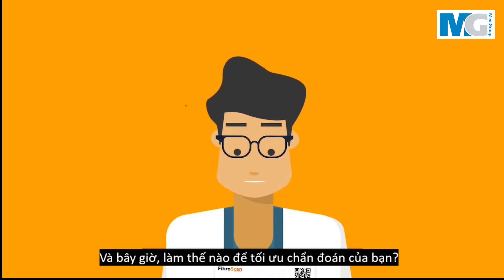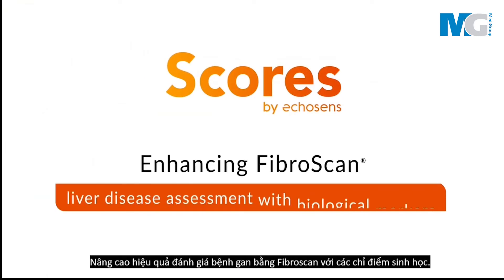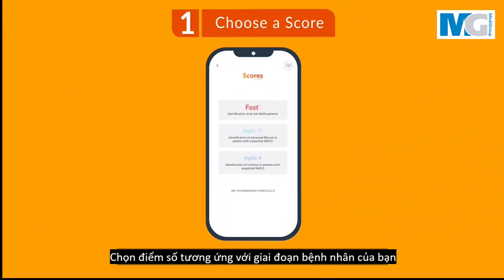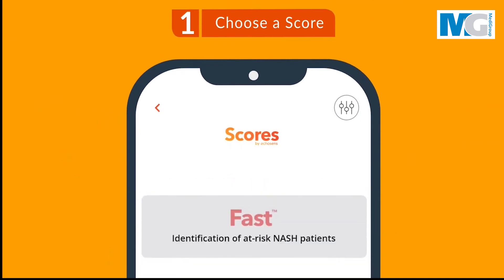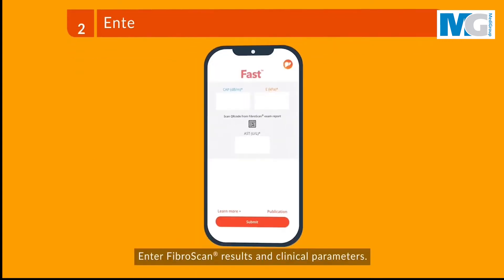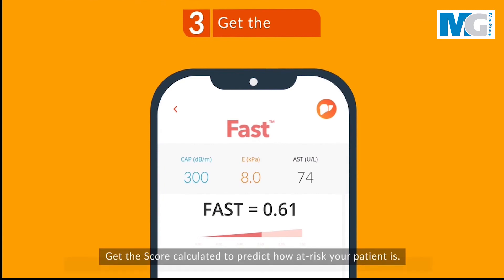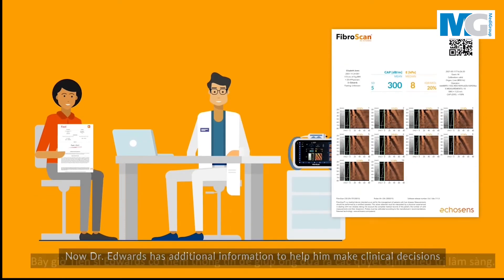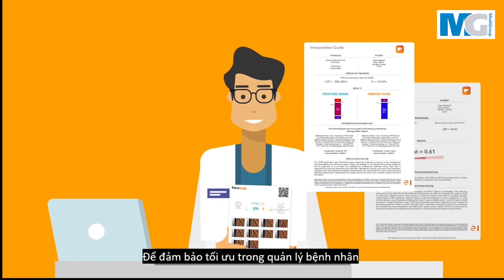How do you refine the diagnosis? Using Scores by Echosense — enhancing FibroScan liver disease assessment with biological markers. Choose a score corresponding to your patient's stage. Enter FibroScan results and clinical parameters. Get the score calculated to predict how at-risk your patient is. Dr. Edwards now has additional information to help him make clinical decisions and ensure optimal patient management.